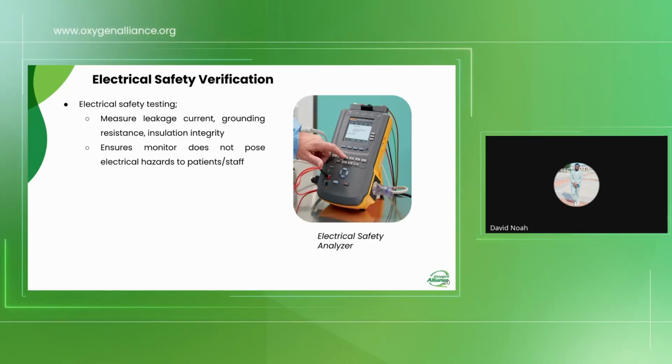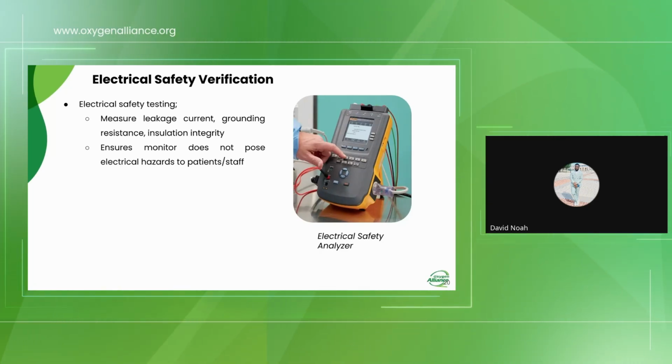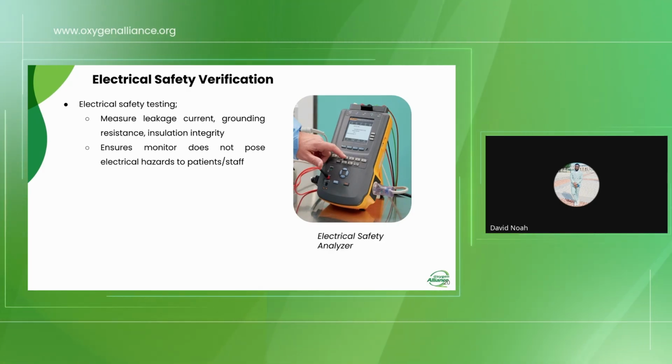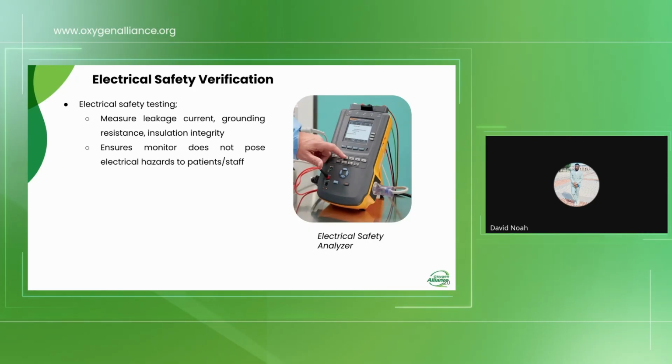Another important aspect as far as preventive maintenance is concerned is that of electrical certification. Electrical safety verification in patient monitors should be conducted annually. Patient monitors are devices connected directly to patients, and at all costs it is important to make sure that they do not pose any hazards. So it is important to conduct electrical safety testing so that we protect both the patient and the user.